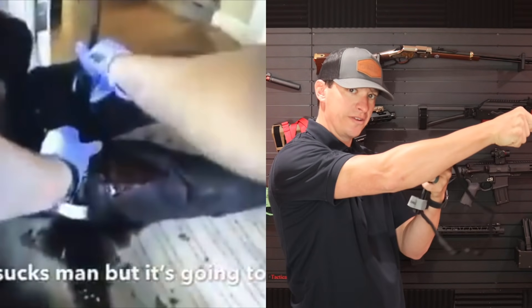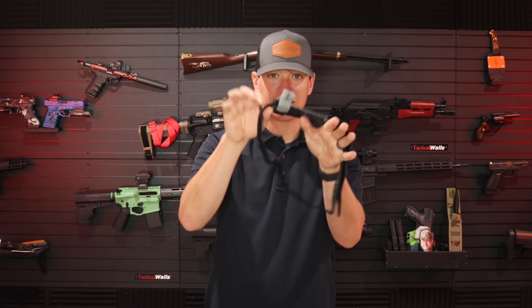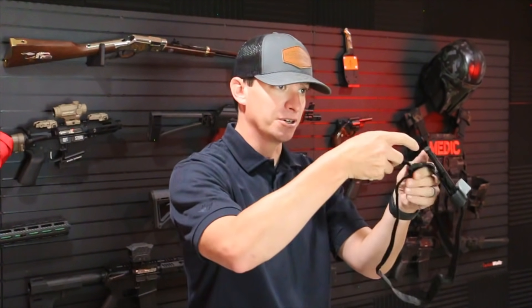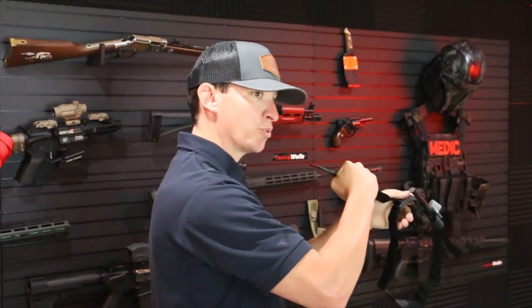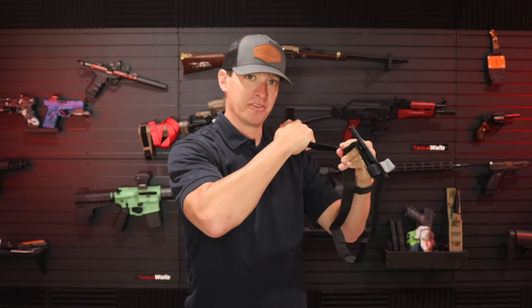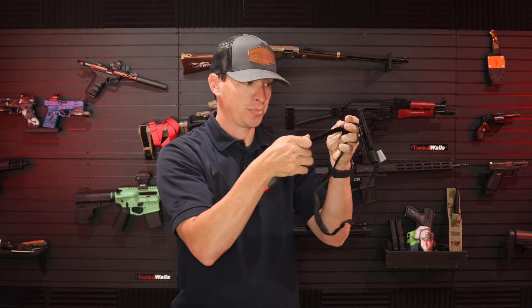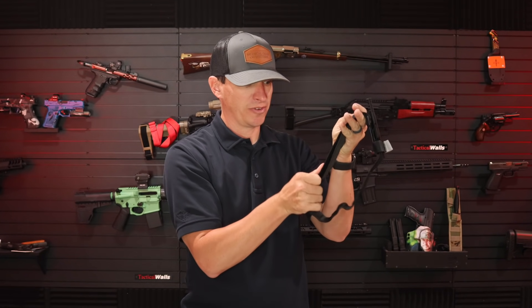The other thing we see is the officer applying the tourniquet pushing away from them. One of the mistakes with these style tourniquets is you don't get that initial wrap tight enough. You get better leverage if you are pulling it towards you. Put it on, pull the red tab towards you, place your hand on top of the buckle, and pull it tight. That way you can cut off blood flow just with that initial pull — get all the velcro secured.